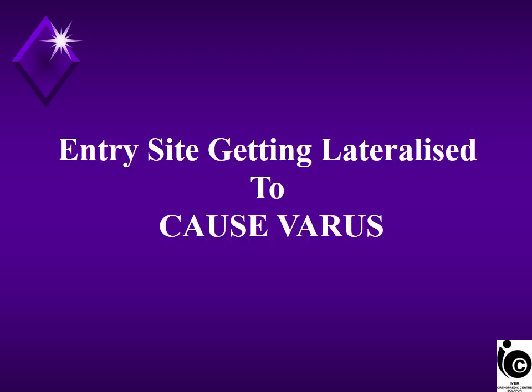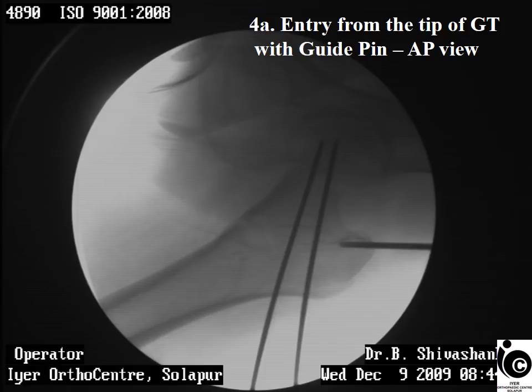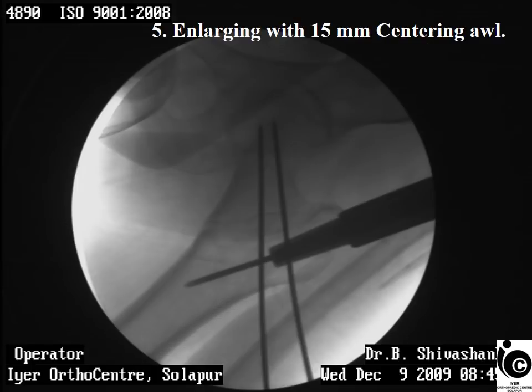Why does the entry site get lateralized and lead to varus? As you can see, the advocated entry for PFN is from the tip of the trochanter, but the bone is softer on the outer cortex and stronger on the inner side. So by the time you ream with a centering awl, you will be reaming more on the lateral side and less on the inner side. So automatically the entry gets lateralized.